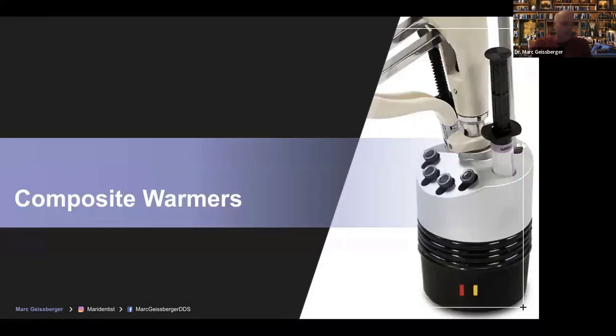Now, one of my greatest tricks that I use is composite warming. Why do I do this? Well, first of all, I'm going to show you some of the literature that talks about why it might be a good idea to warm composites. But first of all, I like to change the handling. I actually prefer a kind of soft or creamy composite.